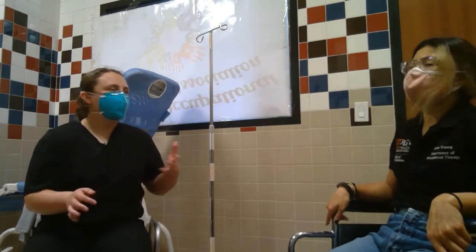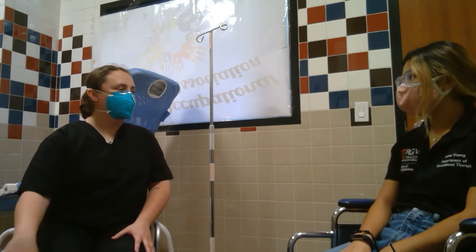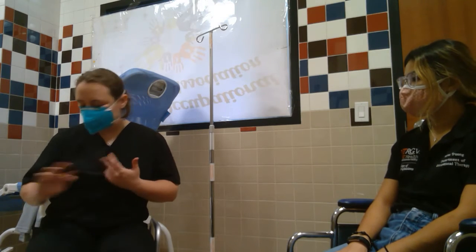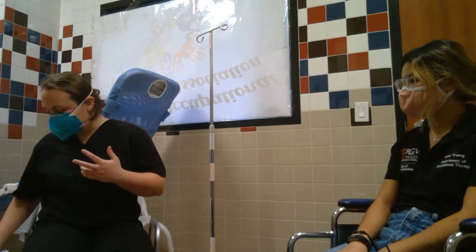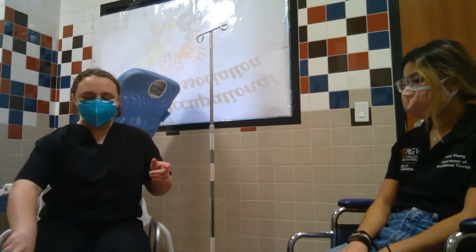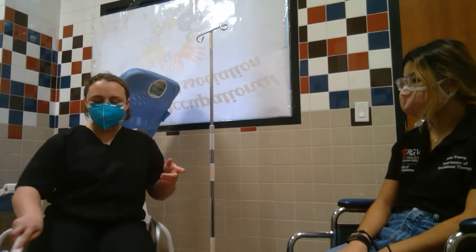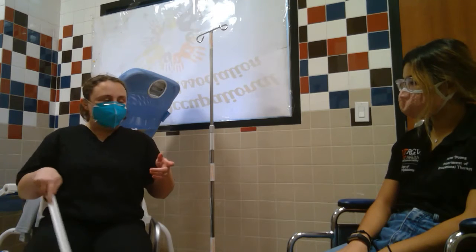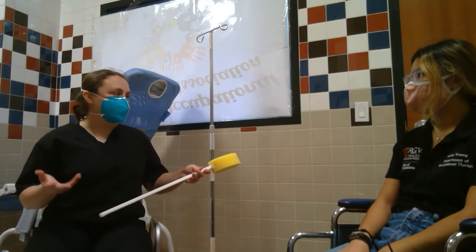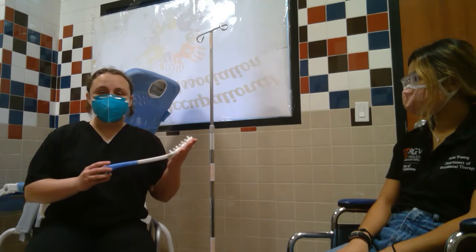Okay, so Rachel, I want to show you a couple of things that are going to make it easier to shower your lower body, to wash yourself. And maybe you've seen these things, maybe you haven't, but I just want to go over them and show them to you. So the first thing is this is a long-handled sponge. Because of those hip precautions that we talked about, because you can't bend, this is going to help you to wash your legs all the way down so that you don't have to bend and you're not going to hurt yourself, and it just makes it easier for you.